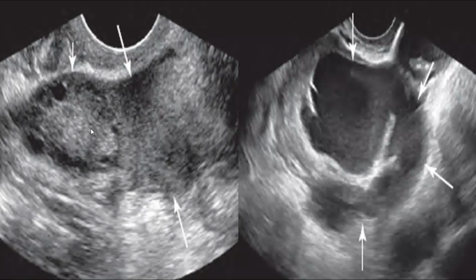And here you can see a transverse transvaginal image of the right adnexa, and it shows the purulent material which shows internal low level echoes. And here you can see the right ovary is visible with peripheral arrangement of small follicles.